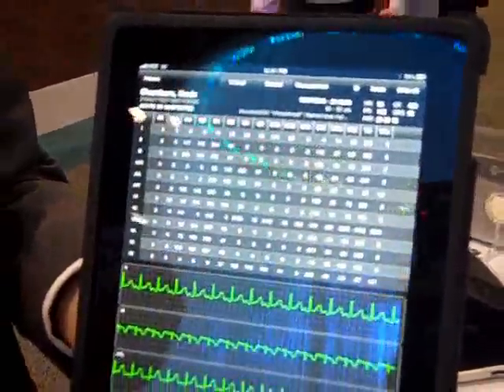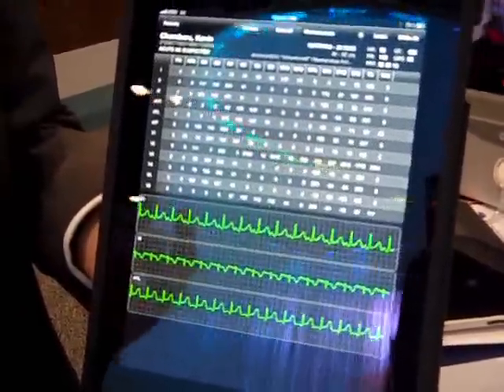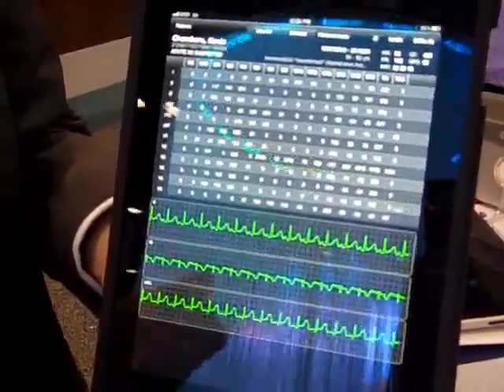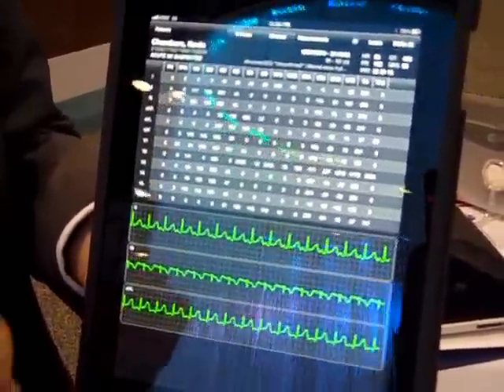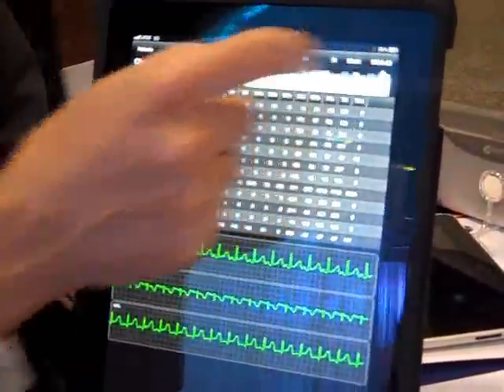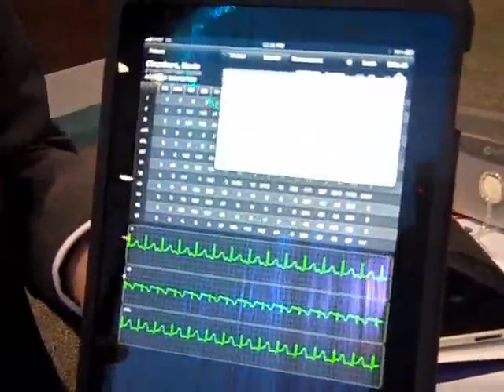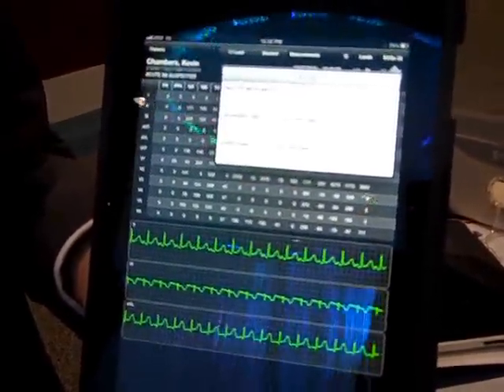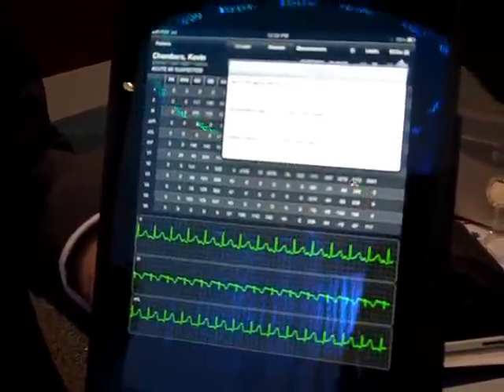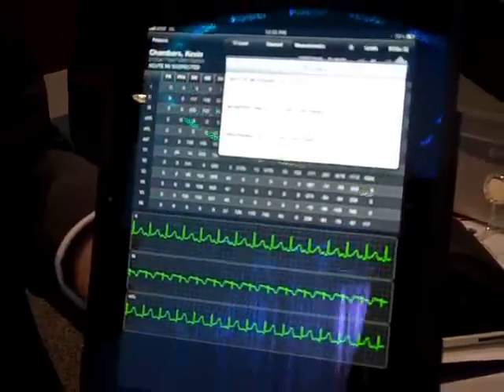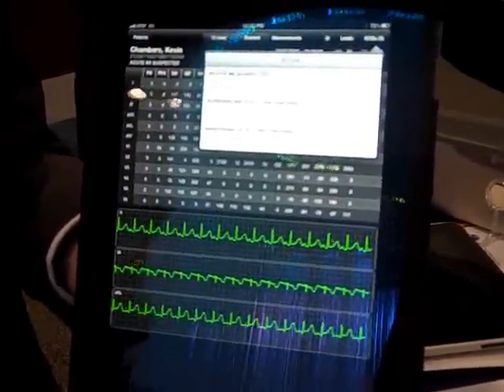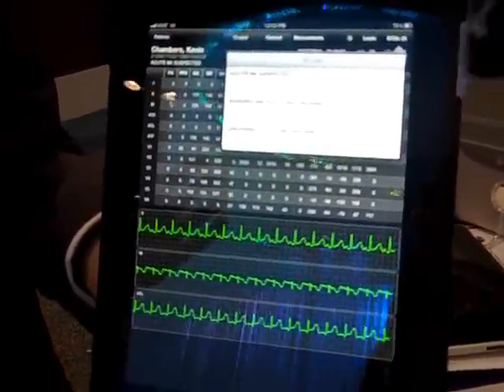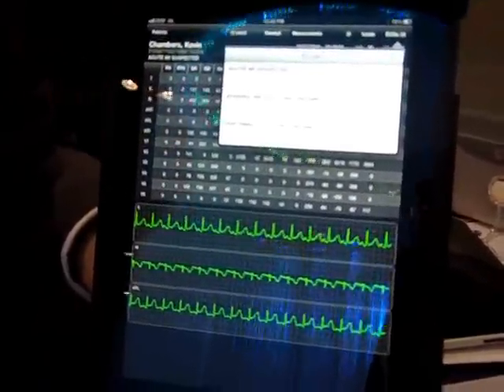Drilling down further, I can get all the numerical information behind these waveforms, as well as pull up historical information on any of the ECGs I might have on file on this patient. I can do a comparison of a particular lead or the entire ECG today versus yesterday versus a week ago versus a year ago.